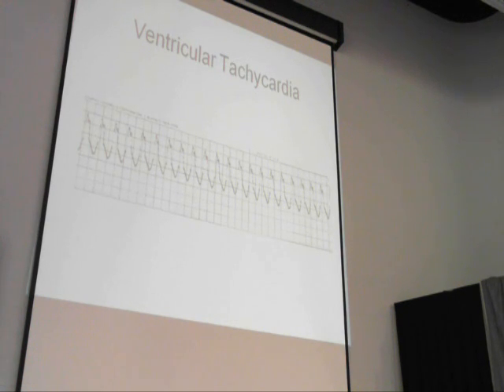If they're intact and have a pulse, but they're unstable, cardiovert. When they've got a pulse, we cardiovert. It's going to be synchronized electricity. Synchronized electricity. Does that make sense? Everybody understand that? Now, if I had said VTAC with no pulse, then you go right to CPR. So they're unstable, but they have a pulse, cardiovert.